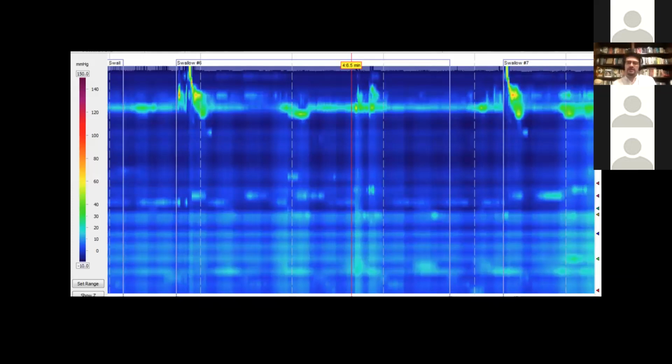Sometimes you won't see the LES, and all you can really pick up is the aperistalsis, such as in this case. My gut feeling for this case is likely a sigmoid esophagus; likely the catheter didn't pass the LES, and it probably just coiled up somewhere in that sigmoid esophagus.